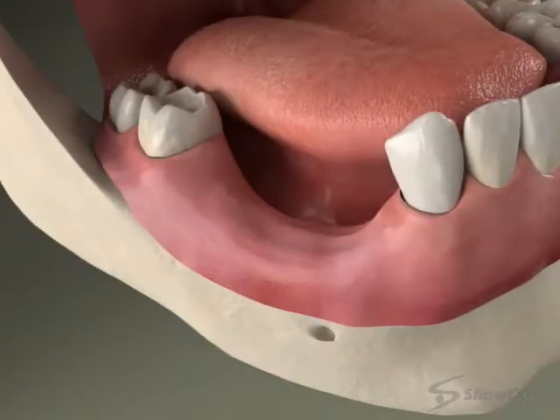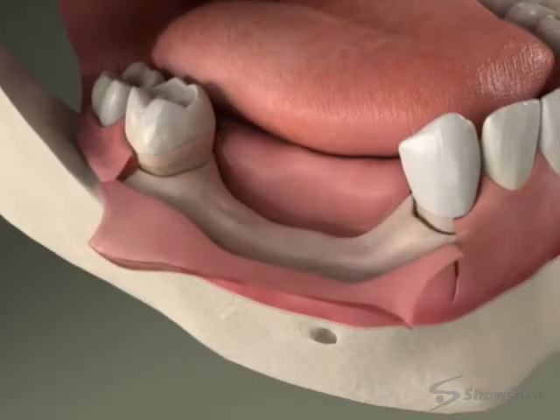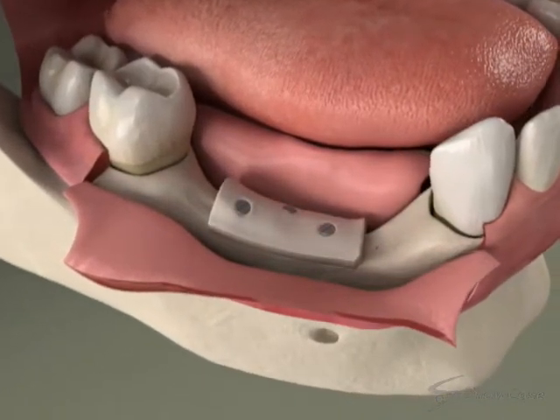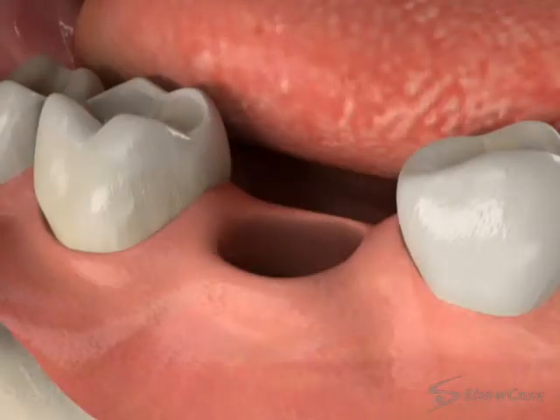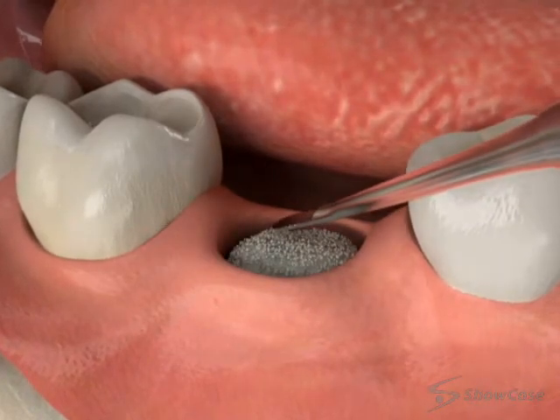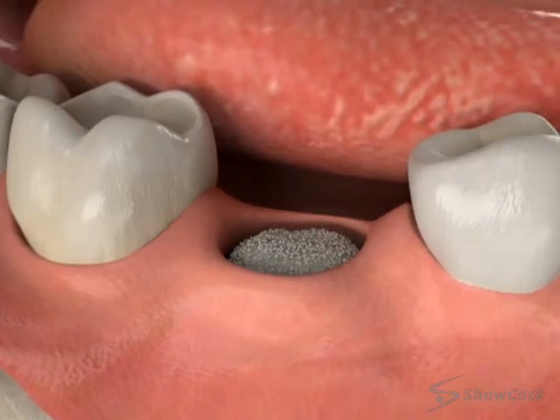In a bone grafting procedure, we gently open the gums and place grafting material onto the areas where the jawbone has receded. With ridge preservation techniques, we fill the empty socket with bone material after the tooth has been removed.